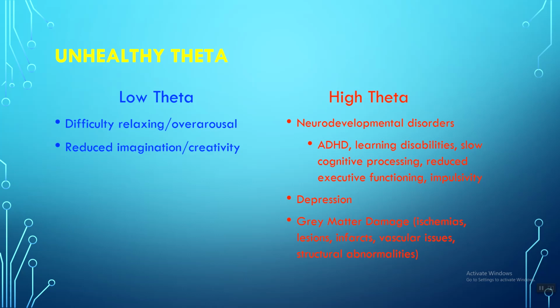Theta we see in rapid eye movement sleep, but then we also see it show up in NREM1, NREM2, and NREM3. So as you are falling asleep, you make midline theta. Theta is seen in nursing infants as well. Right around 6 months, they start to produce theta, and it's called hedonic theta. Hedonic theta, like, oh, that's so good theta, like hedonism theta.